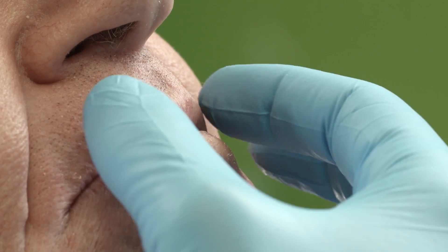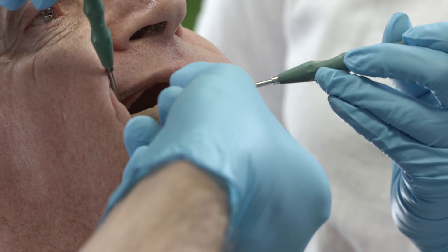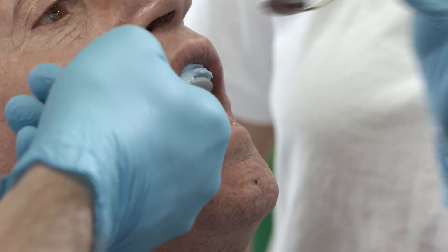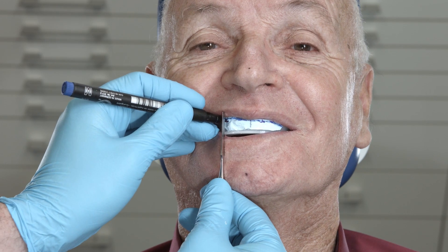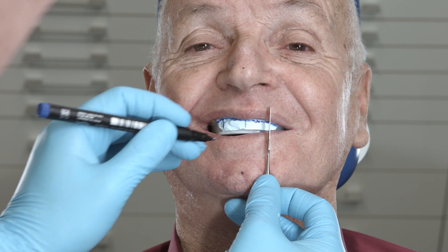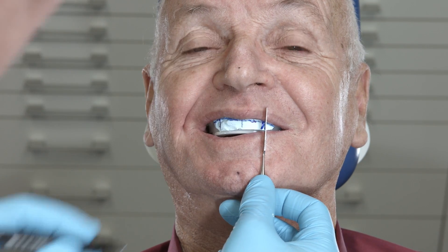Check the lip support and the buccal corridor. Make the necessary adjustments by cutting back or building up wax or silicone. Now mark the midline, the smile line, and the cuspid line as information for the dental technicians. They will lightly cut these lines with a fine round burr before the scanning procedure.